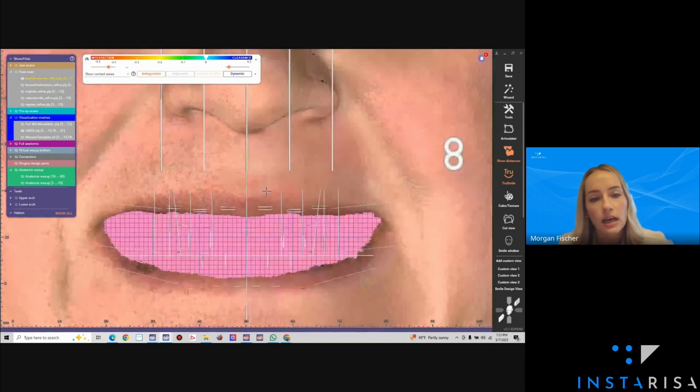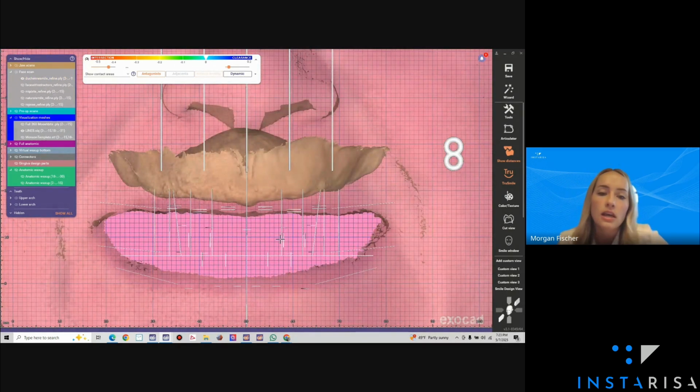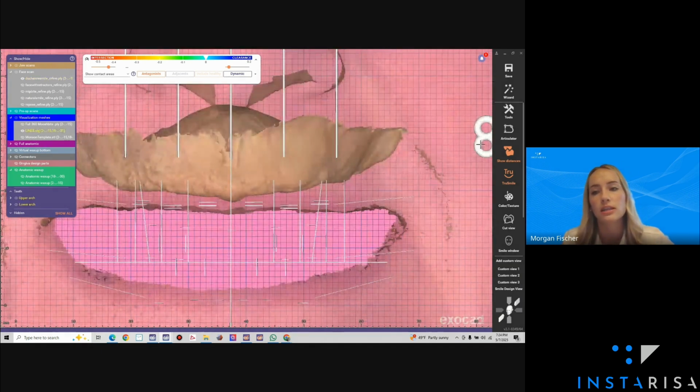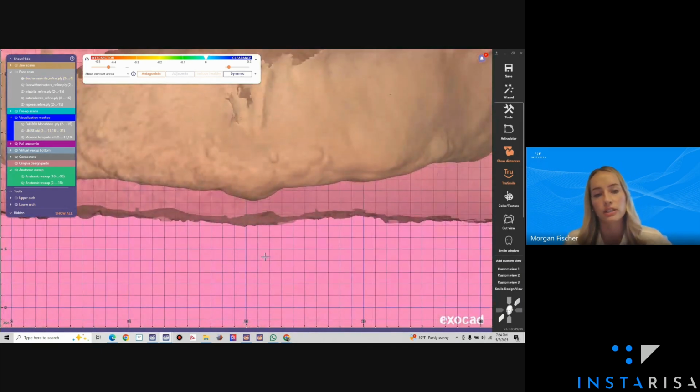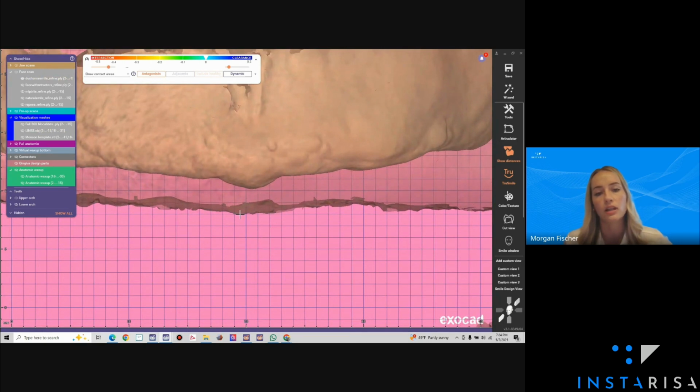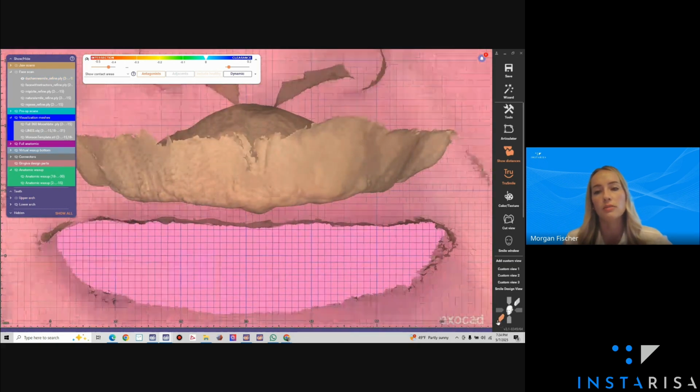So ideally, in measurement, we like to see about 2 to 3 millimeters above the upper lip position in repose, which it looks like she is already there. I can make her Duchenne smile here transparent. And like I said, these grid lines are a millimeter apiece. So I'm seeing about 2 to 3 millimeters, even in Duchenne.